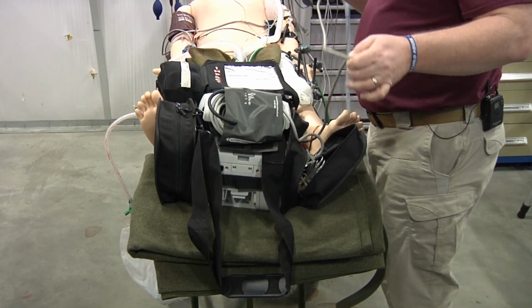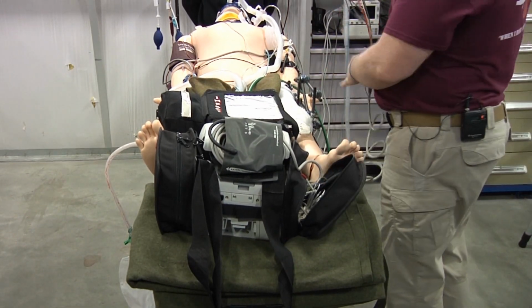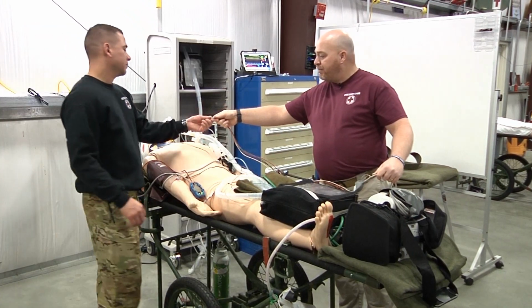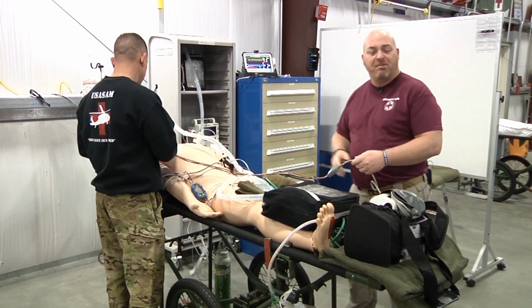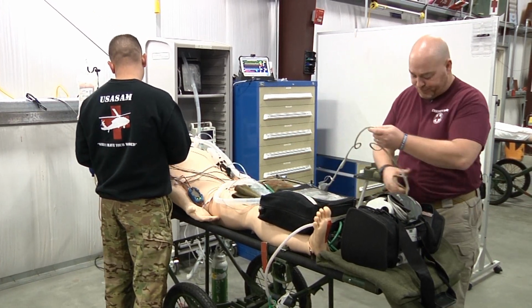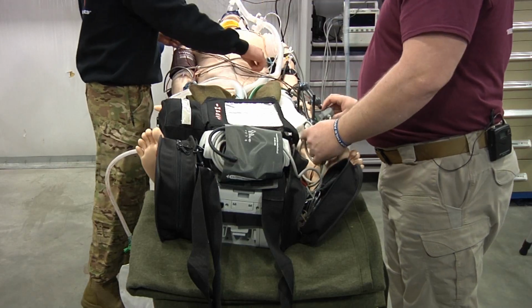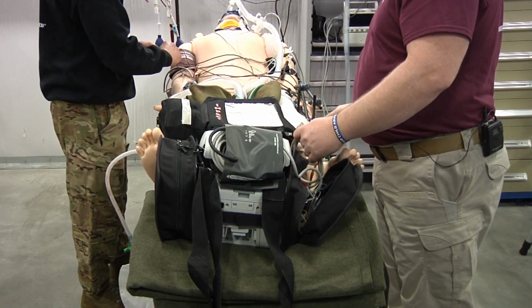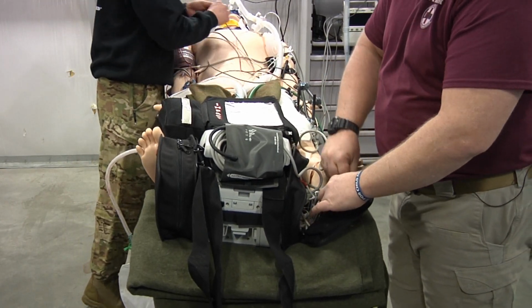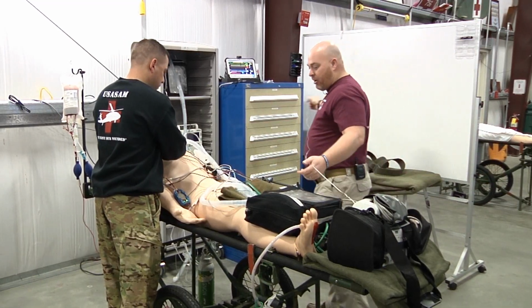So I'm going to pull out one piece at a time. This is just a technique. And I'm going to run it down one side of the patient. My partner is going to start hooking everything up that we're putting on and replacing it with what the hospital has on there. So we're going to remove the hospital stuff and we're going to replace it with our stuff. As he's getting that hooked up, I'm keeping it neat down the side. And then anything not being used, I'm putting back in the bag. I'm also going to ensure that we're getting our EtCO2 hooked up.